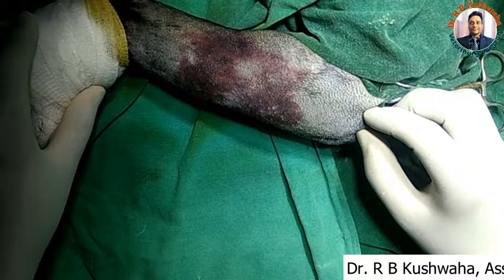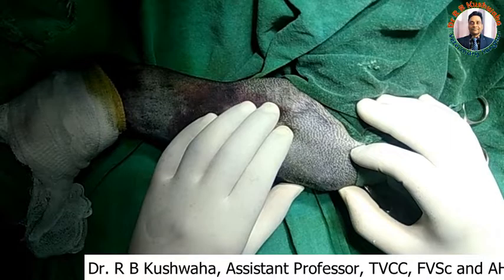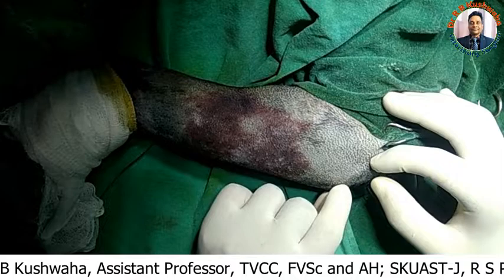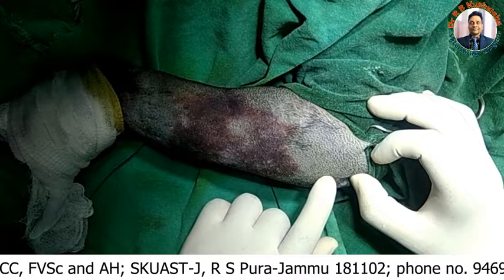Landmarks for this procedure: this is the anterior side and this is the posterior side. This is the left tibia. This one is the anterior tibial tuberosity, this one is the medial tibial tuberosity and depression, and this is the tibial plateau. For intramedullary nailing with antegrade pinning, we insert the pin from here.